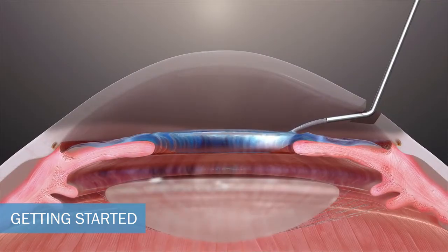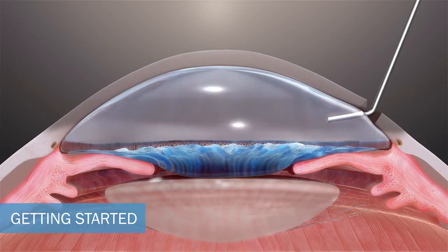Next, the anterior chamber is inflated and pressurized with a cohesive viscoelastic.